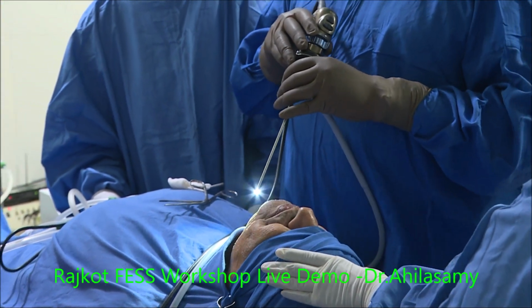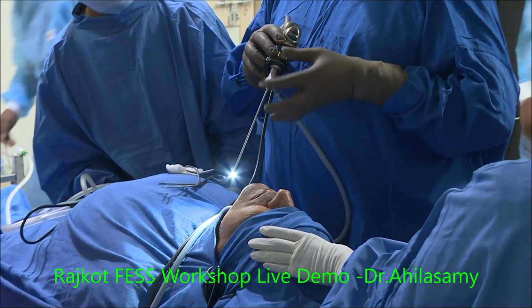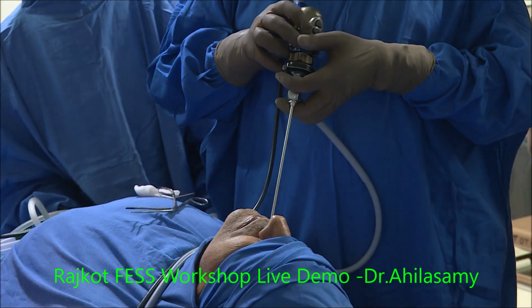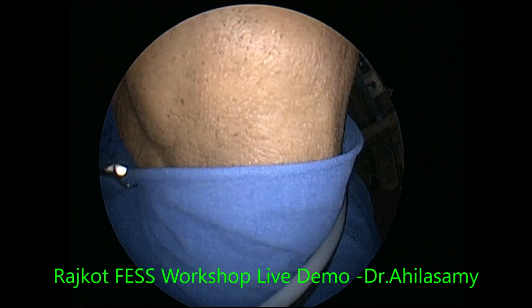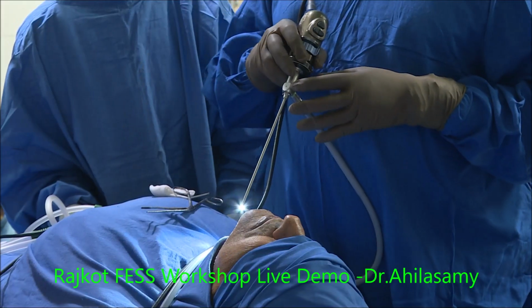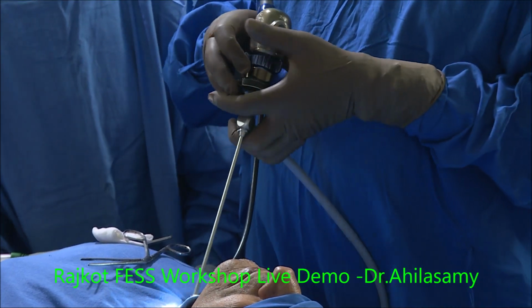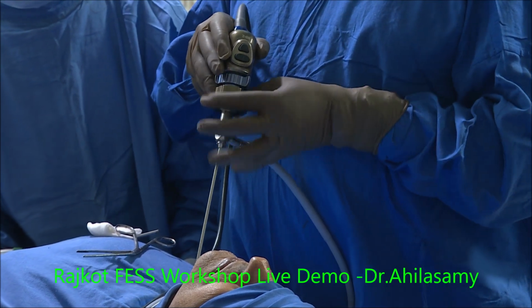Many people hold the endoscopes differently. Some hold like this, some hold like this, some hold like this. Are you getting the picture of my hand? Holding the camera, some hold it like this, some hold it like this, in various ways.